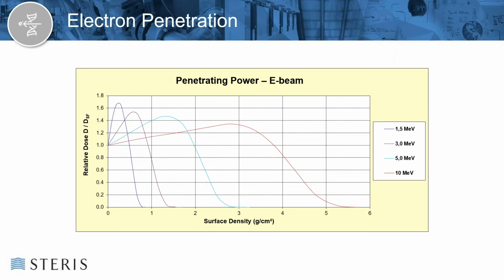But you'll see this family of curves has this characteristic shape. And this is something that we can't avoid. With all our expertise, this is physics. This is how the electrons distribute within our materials. Customers will come to us with certain needs for dose uniformity, but ultimately we'll be limited to what physics can provide for us in terms of the physical dimensions of the products and how those electrons scatter within the material and how dose builds up, as you see here in this diagram.